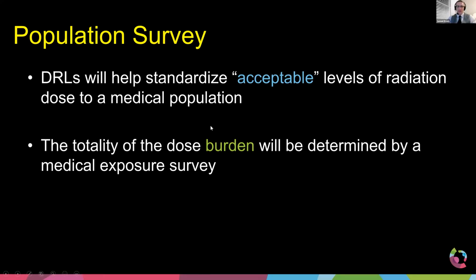This will help us understand how we use our imaging on a day-to-day basis. But the question I had from the very beginning, in the first week, when we talked about radiation dose risk: in Thailand, for example, your natural background radiation is very, very low. Therefore the type of radiation your population is most exposed to is actually from medical imaging. So what is the total dose burden from imaging to the Thai population?